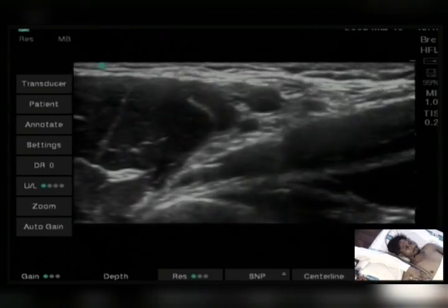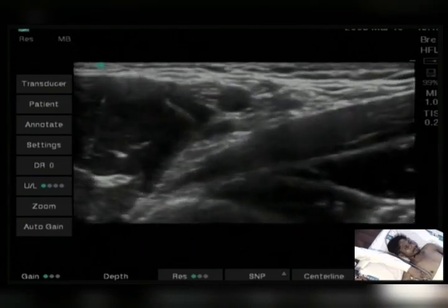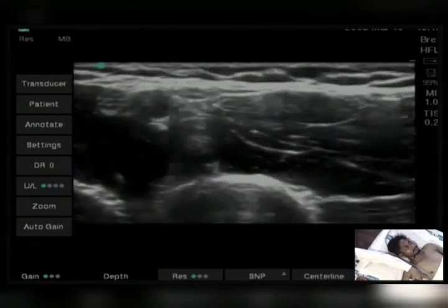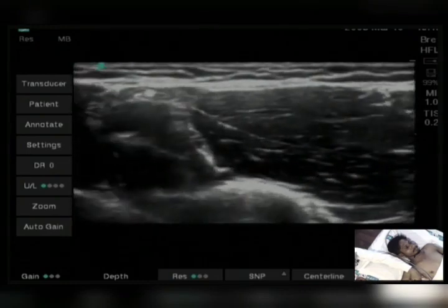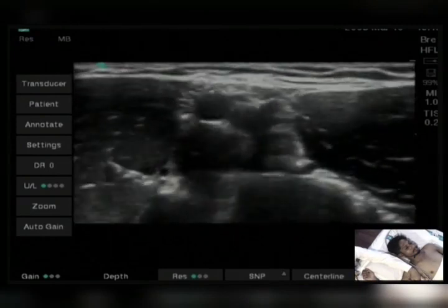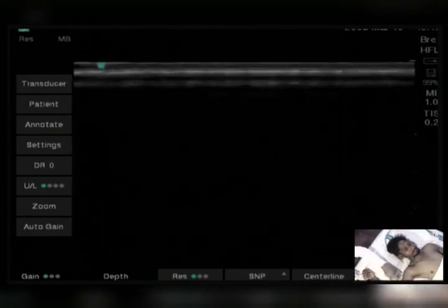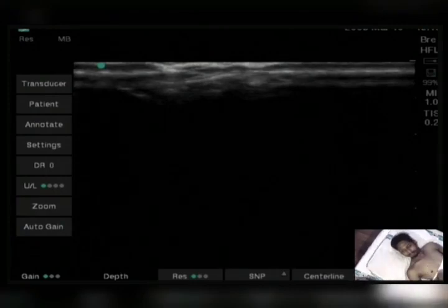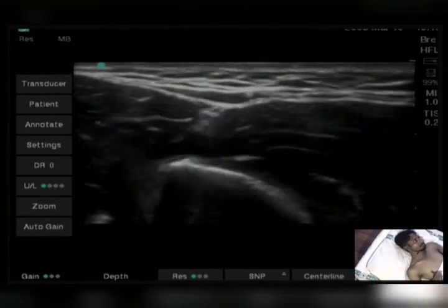And this is the conjoint tendon, and somewhere you find the radial. Radial goes on the lower part and medial. This one. Okay. If you can't visualize the radial, you can trace it over here at the elbow level. Here you will find the radial.